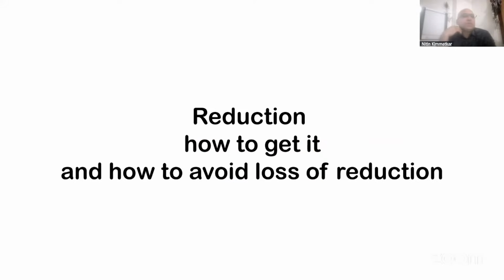So how do you reduce an intertrochanteric fracture? Most of us just see the X-ray of the intertrochanteric fracture, and we put the patient on the fracture table, put it in abduction, adduction, and check the images in AP as well as lateral. As we have only one implant to put in, that is the PFN nail, we don't bother about what reduction we are getting, how to negotiate that factor, how to do a stable reduction.